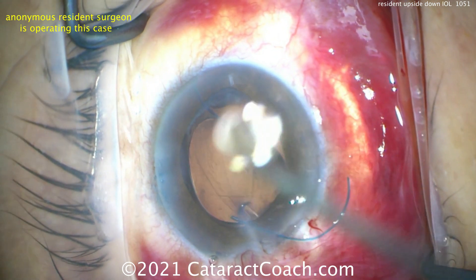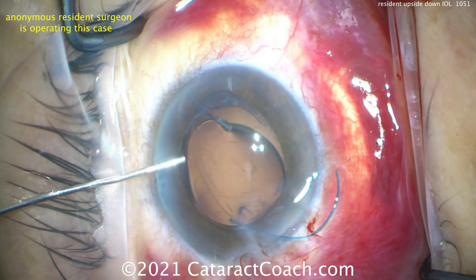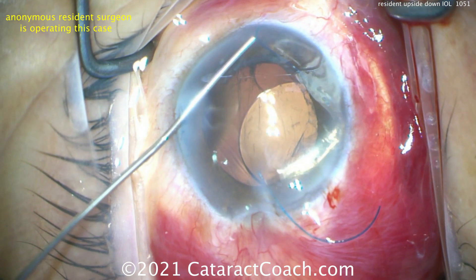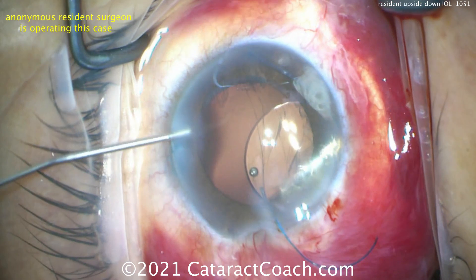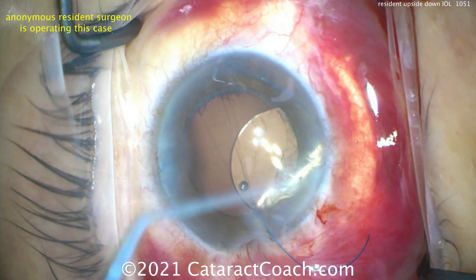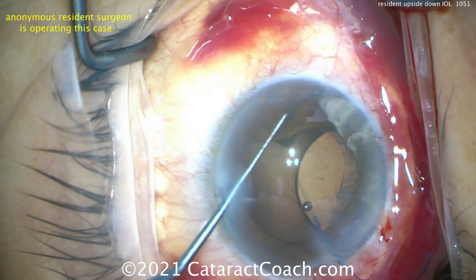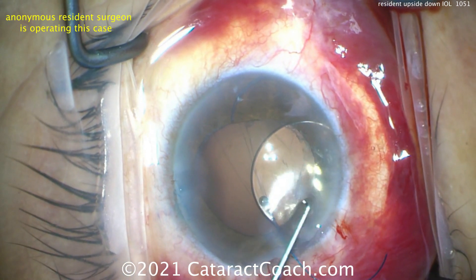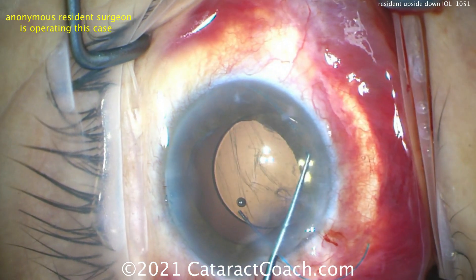There it goes — but you have to be careful. Look at the posterior capsule: is that just a wrinkle, or is the posterior capsule now damaged? Hard to say. The haptic is still stuck in the iris. Inject more viscoelastic. That certainly looks like a damaged posterior capsule now. All this happened because we simply weren't sure how to load and deliver the lens — a mistake that could have been prevented by studying these cataract techniques.